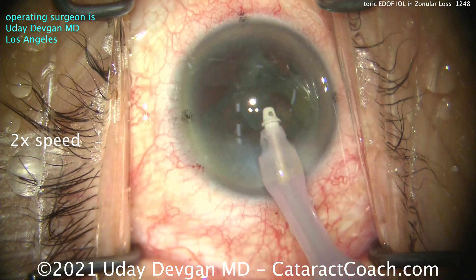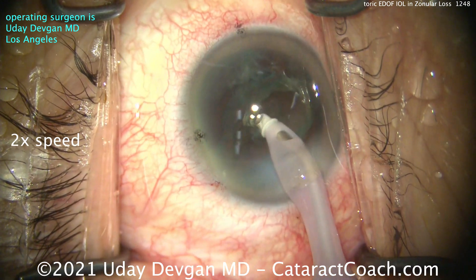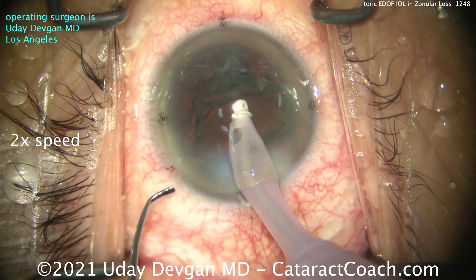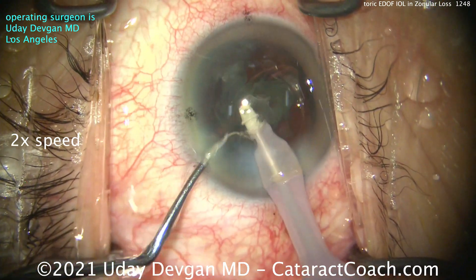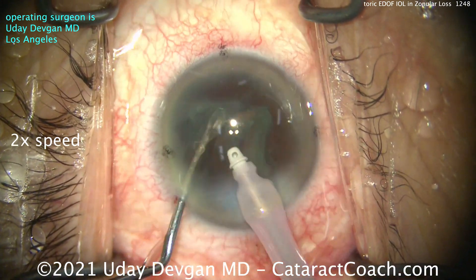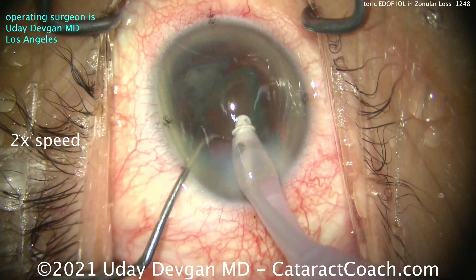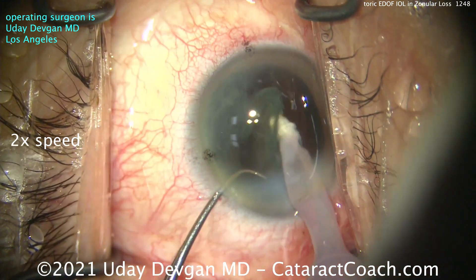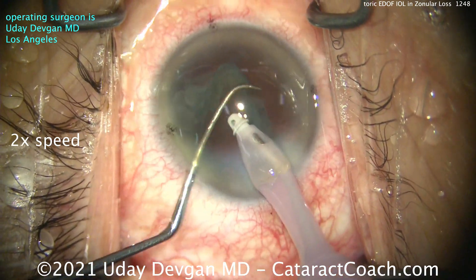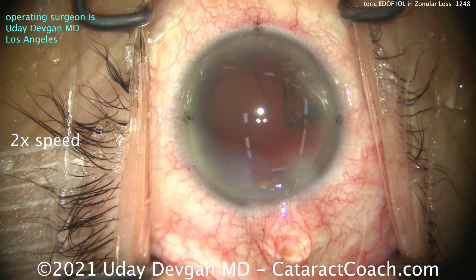IA probe going inside the eye. Try not to remove any of your viscoelastic — try to keep that port occluded. If the port's not occluded, don't hit the vacuum. Stay in position one. We're going to get that big epinuclear shell up. Nice and easy, take your time, keep the tip occluded. And what are we going to do here — are we going to be able to put in a toric EDOF lens? EDOF, extended depth of focus. This lens has to have that central light-shaping element really well centered.